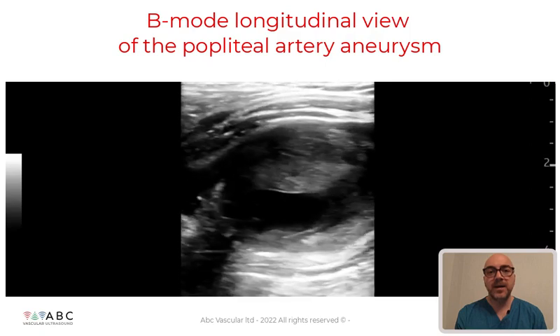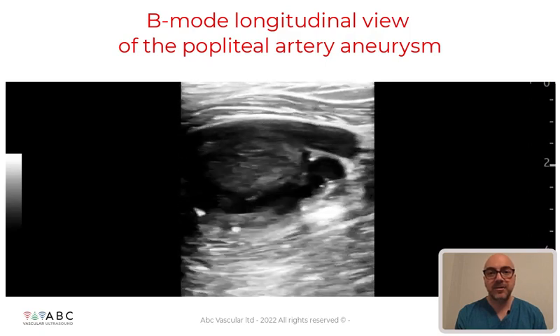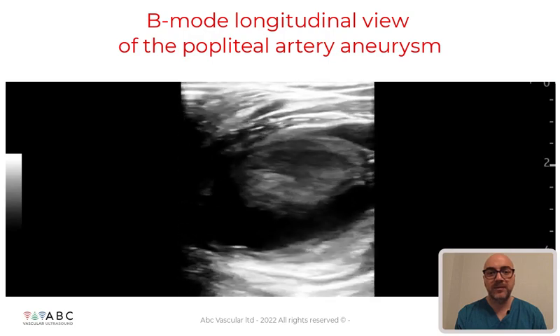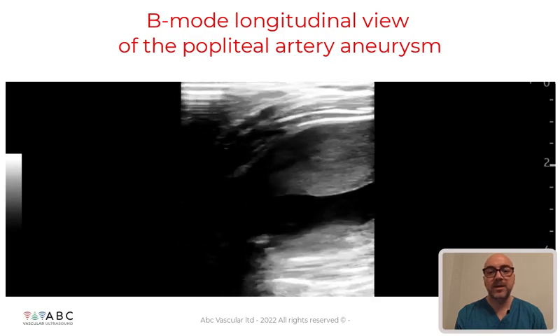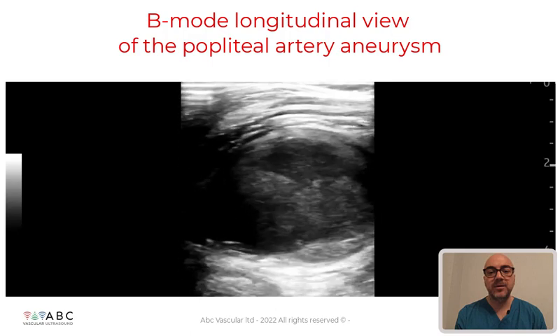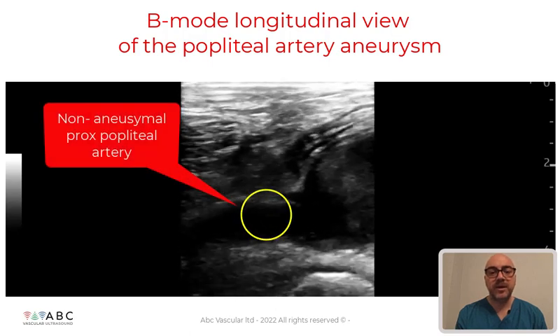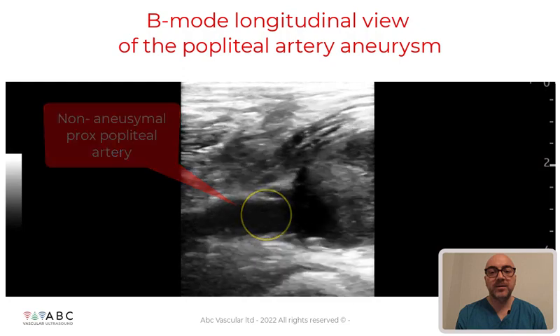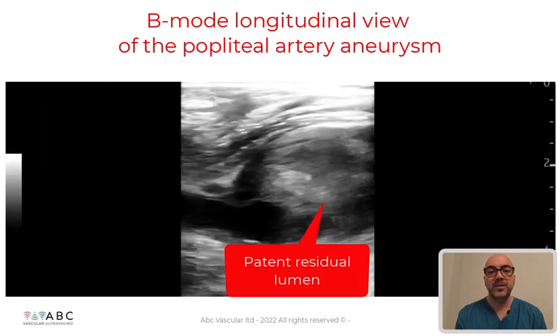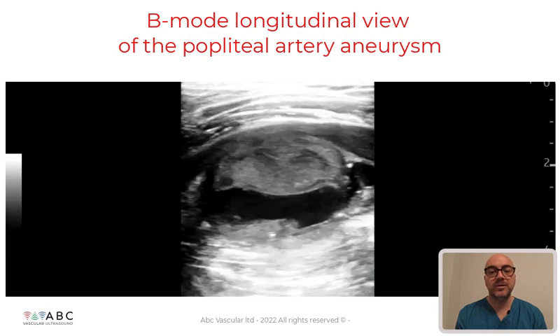By using the longitudinal view we can better understand the shape of the aneurysm, which is indeed fusiform. We can again identify the proximal and distal non-aneurysmal regions of the artery, and we can also identify the patent residual lumen and assess again the mural thrombus.